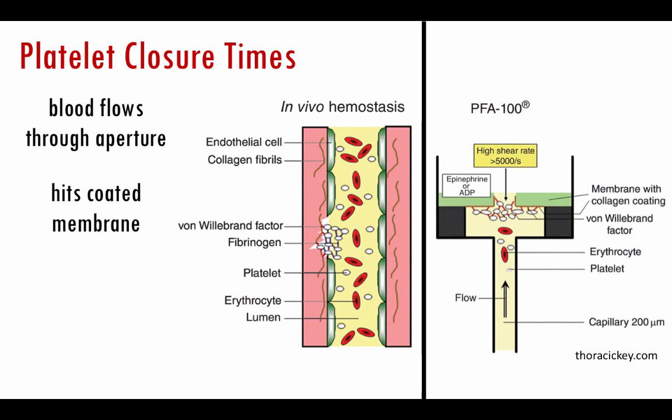When platelets get to it, if they function correctly, we have enough, and the other factors are present in the bloodstream, then they will start to clump. This initiates the clotting, and as the platelet clot is building up, the fluid that's normally flowing through this little hole eventually stops, right? Because the platelets have closed the gap. And so as a result, we can measure that stoppage time.